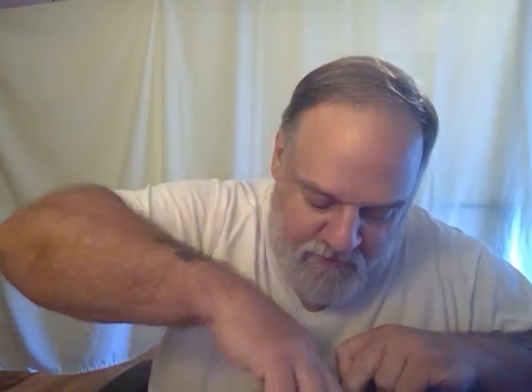So you put this compressed bandage back in the bottom. That's where that goes, all the way down. Then you put in your lightning hemorrhage control bandage right there at the top, because this one's something you want to be able to get to quick. You put your tourniquet above your cut, you know. Put your tourniquet up here, catch the blood down there, stop that blood.